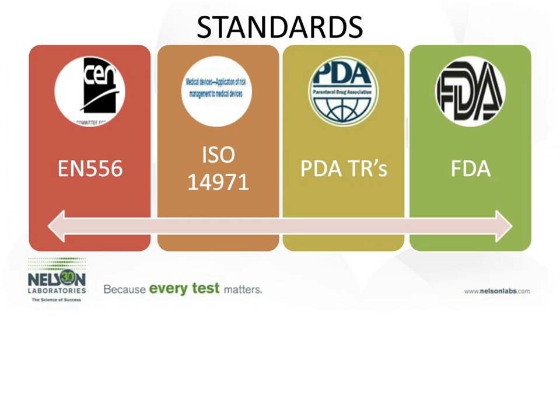Now, the slide here is just an overview of the standards that are out there right now, and also what we are relying heavily on as we put these documents together. EN 556 is the European standard that is comparable to AAMI ST67. However, in that document right now, a product is not able to be labeled sterile unless it actually meets a 10 to the minus 6 sterility assurance level. And that is something we will be addressing with different approaches in the upcoming documents.